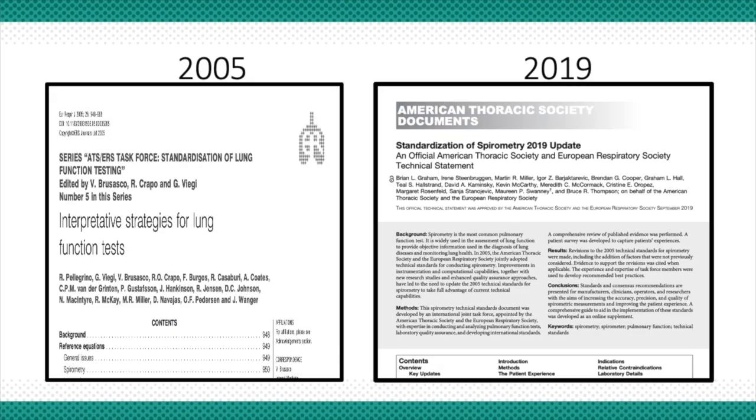So spirometric interpretive strategies and technical standards have undergone a change since we last knew it. First, in 2005, major changes in spirometric technical standards were brought about, but these were changed in the pre-COVID era to a 2019 statement, which I must say was lost mostly under the layers of managing the COVID disaster.